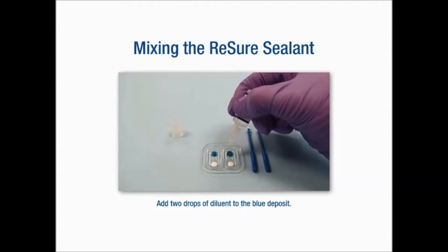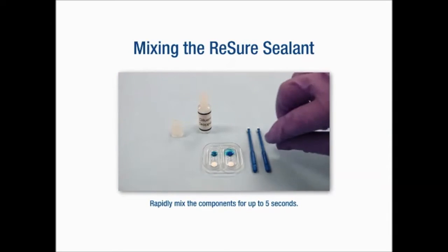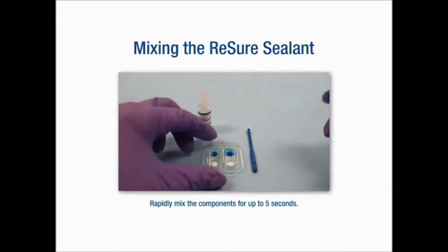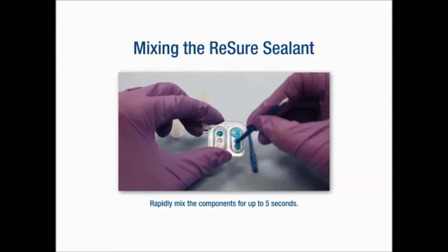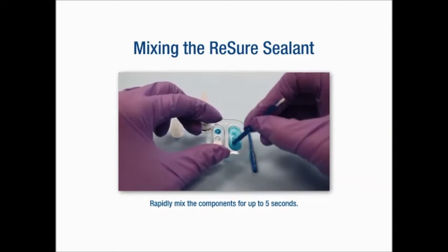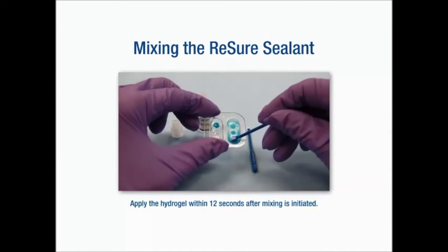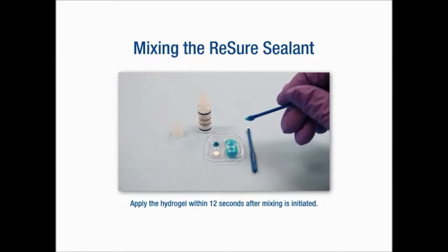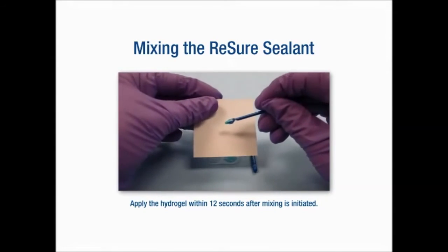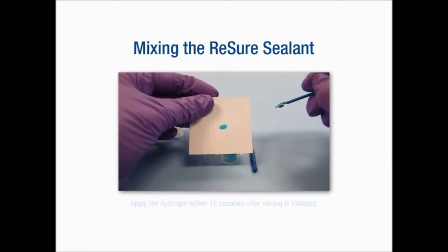Put two drops of the diluent in the blue, over the blue dot, and mix it using the back end of the special spears that are provided by Ocular Therapeutics. You mix it for five seconds, and then you have 11 to 12 seconds to apply it before it polymerizes. The blue will disappear in about an hour — that's just there to give the surgeon good visibility.